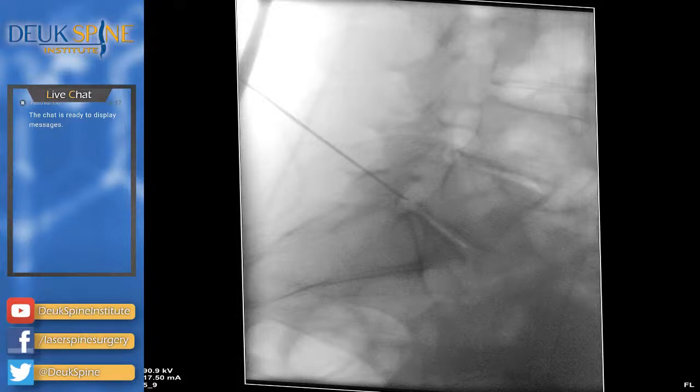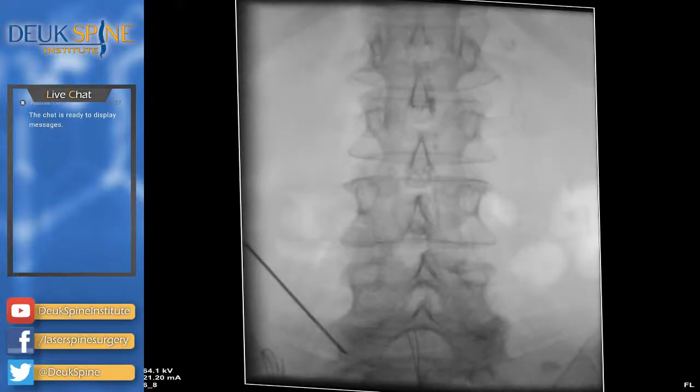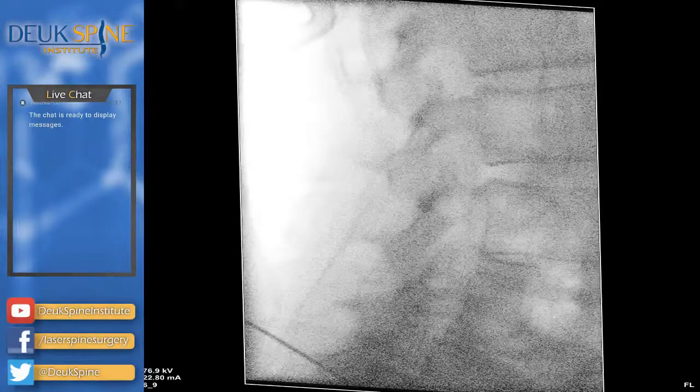Man, I don't know how you got that lateral, but that is absolutely amazing. Like I say, better to be lucky than good. Hey guys, not too close. That looks good. Go back to a lateral. What were you saying? No. You'll get it. Everything's going good, okay? Need to be further south.